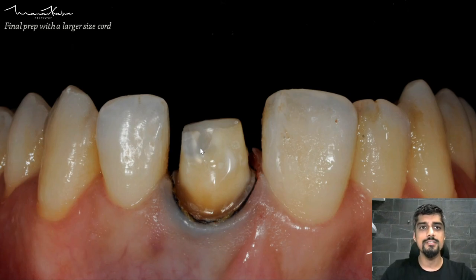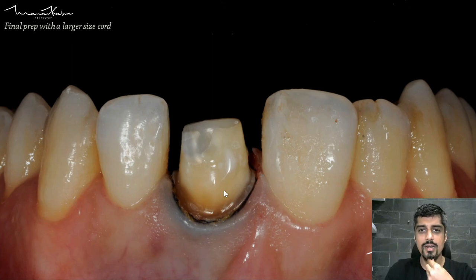This photograph represents the final prep with the larger cord in place. What you need to see is that the gingiva is away from the margins of the preparation — this is how you know you have got adequate retraction.